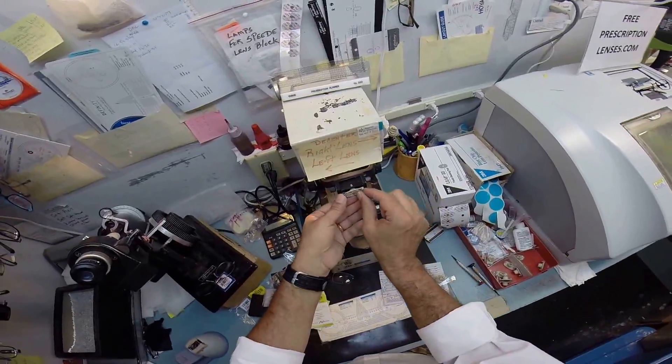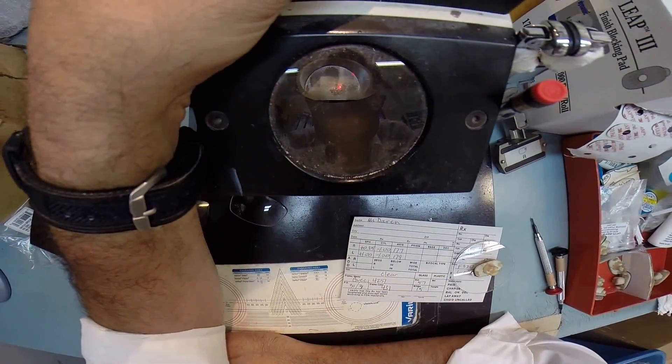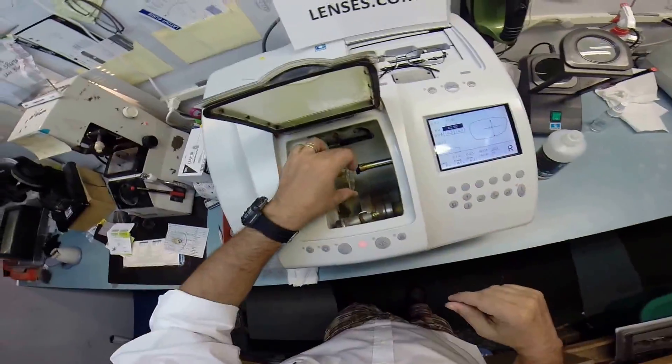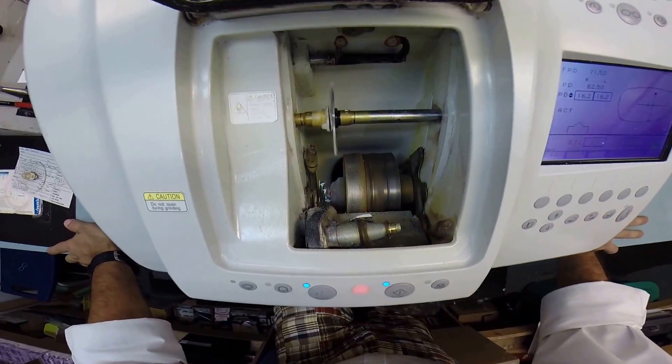I need to do the same thing for the left lens now. Pull that away, get everything lined up, and I'm going to put the block on that. I'm going to take your right lens and put it into the chuck — or as I like to say, the Charles — because I don't know this machine well enough to call it Chuck. All right, bad humor, I know.